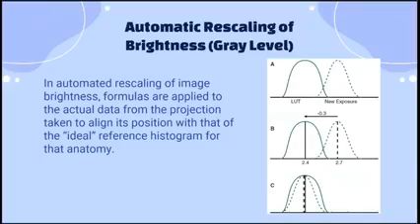There is an ideal LUT, and there's this LUT that I have acquired from the exposure of the PSP plate. Okay, so this one is the ideal LUT or the ideal histogram, and this is the new exposure that we have acquired. Okay, so since we need to align it with the reference histogram or LUT, we have to adjust its, what do you call this?